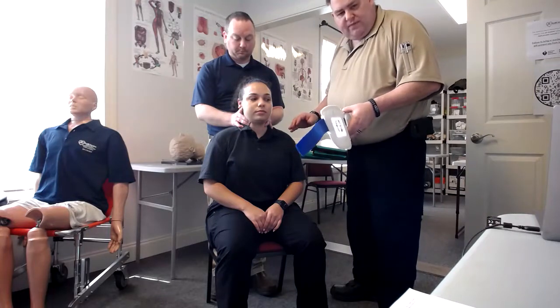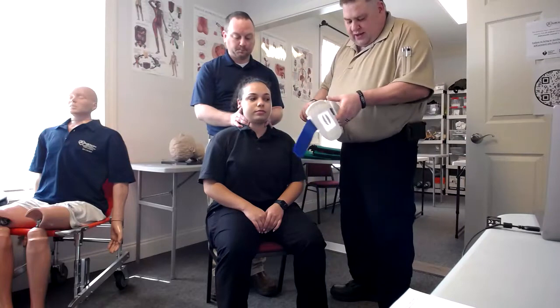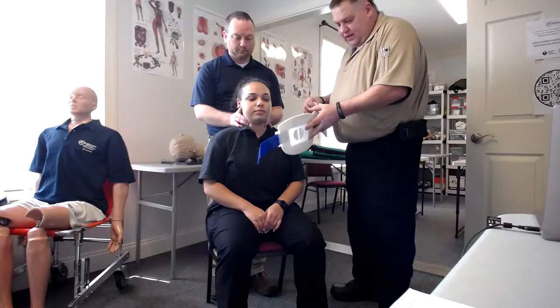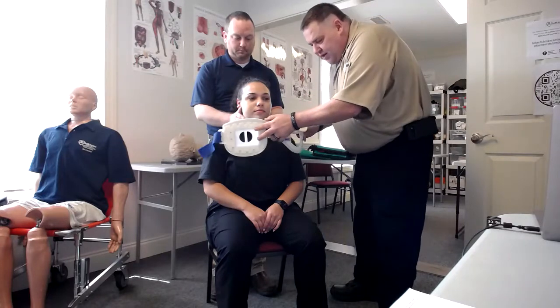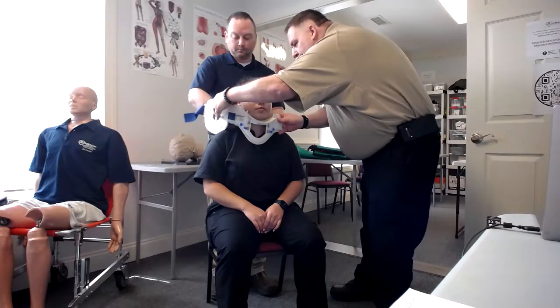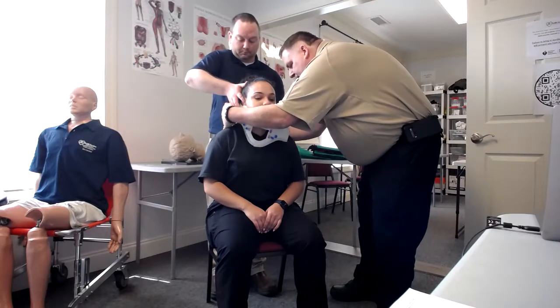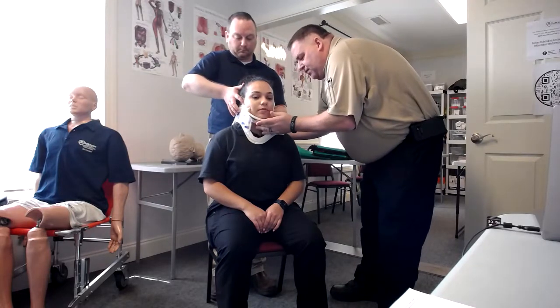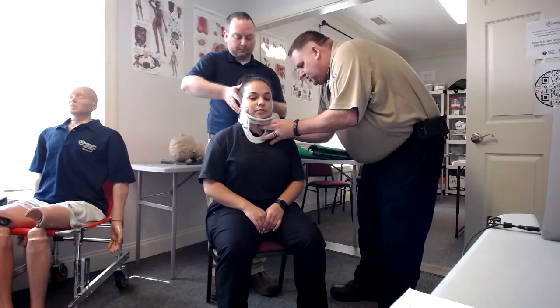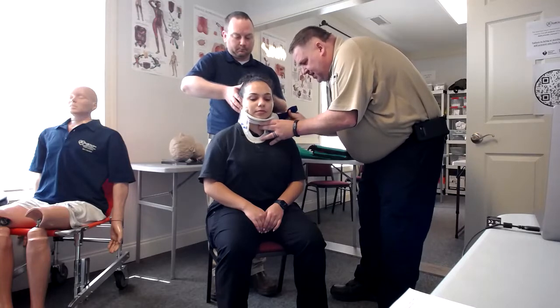We're going to measure the patient for a C-collar. In this case, we're measuring the patient — she's going to be a no-neck. So we're going to get our C-collar adjusted to the right size or get the appropriate size C-collar. We're going to be reaching in, coming around, and moving this around behind the patient. The patient does not move — sometimes your patient wants to help you, instruct them not to. Try not to catch the patient's hair when you have a female with long hair, because it does not feel good on them.